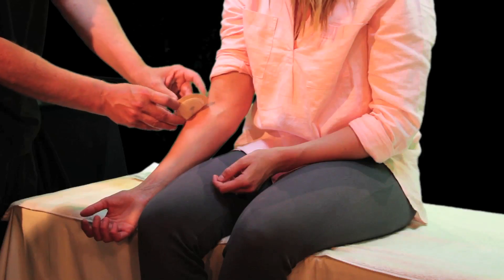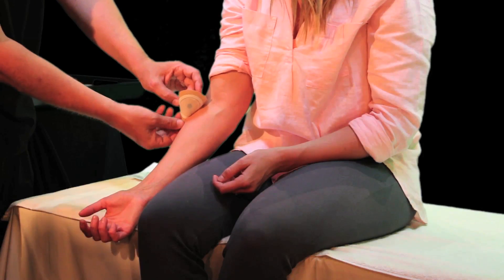Work around the patch from the edge. If any residue has built up, clean with soap and water.